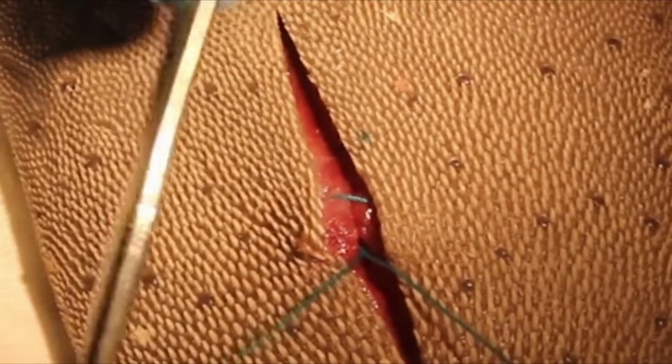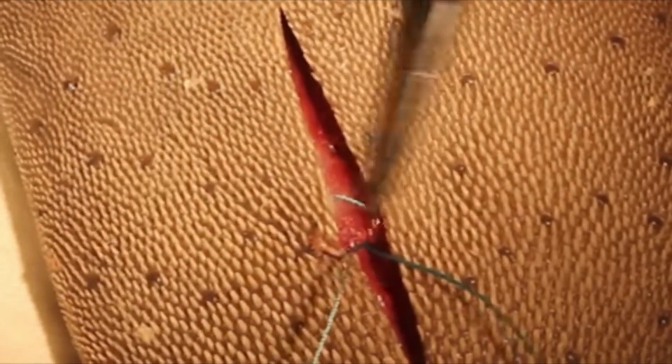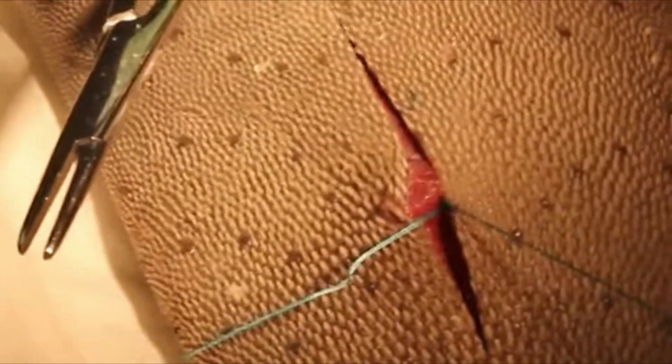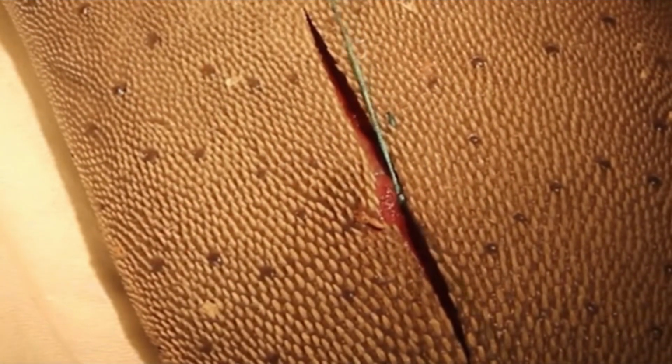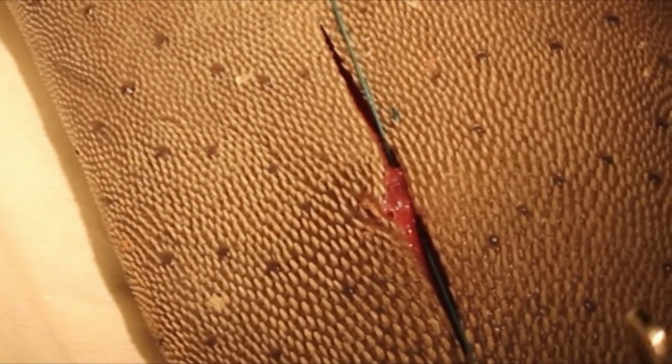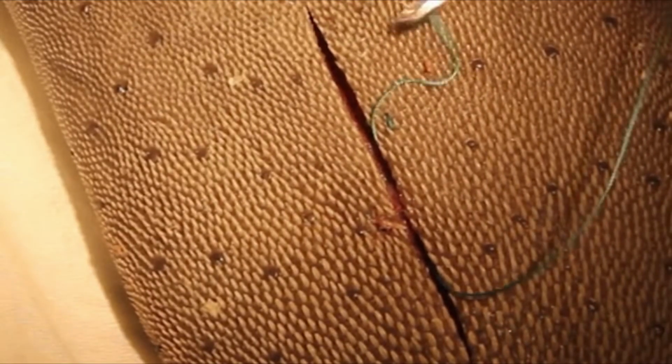If one strand is superficial and the other is deep, the knot will migrate upward and sit where it does not belong. Tie with an instrument tie. The first throw is wrapped twice to create a surgeon's knot that holds tension. When cinching down, pull the strands in the direction of the wound, not straight up. Pulling parallel approximates the edges and helps the knot flip down into the depth.